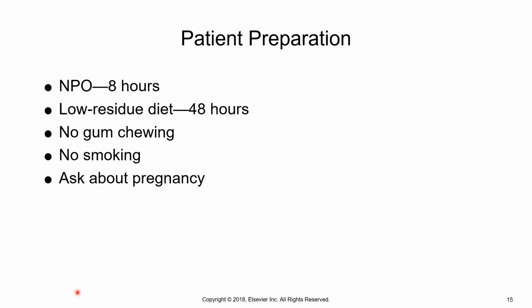Contrast media. The patient prep for this is they are NPO for 8 hours prior to the exam. Yep, still looking, still not finding it. Okay, NPO at least 8 hours.